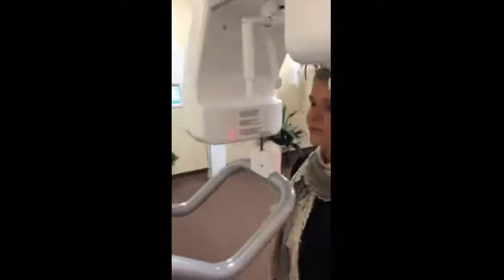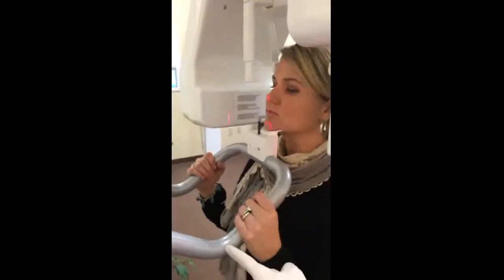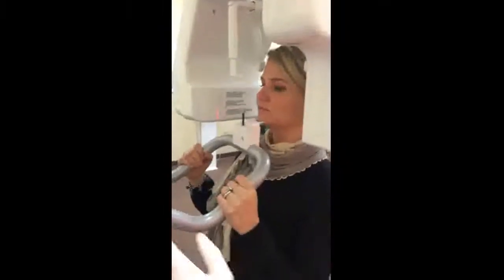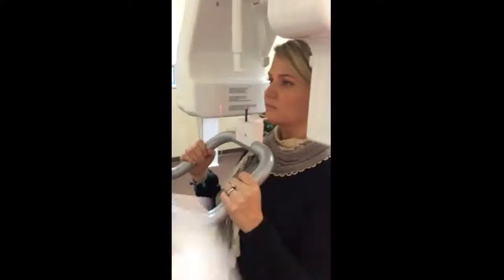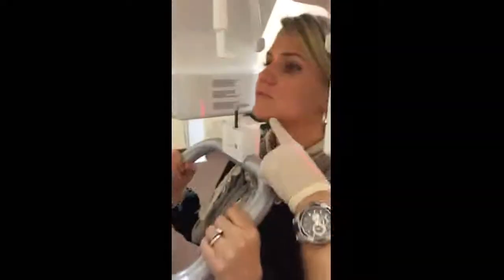You'll have your patient step close to the unit and grab the handles. You'll place your foot just below the bottom of this V so that the patient can step up till they hit your foot. Have your patient take her chin off the chin rest. Look straight ahead. We're going to set this chin rest at the crease in her chin.